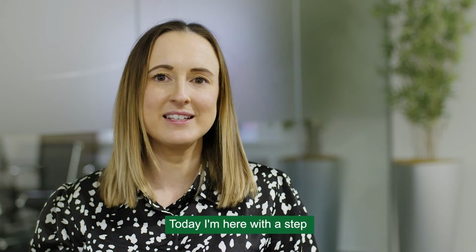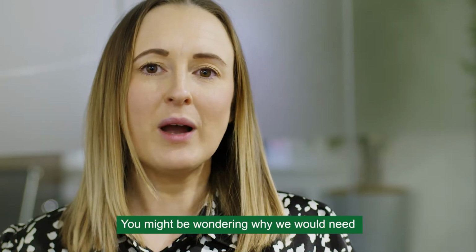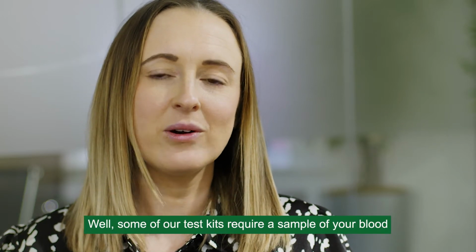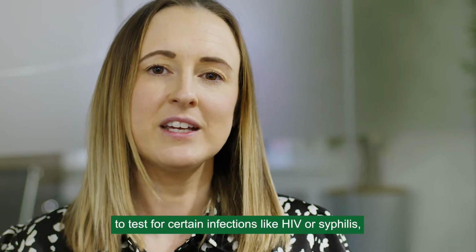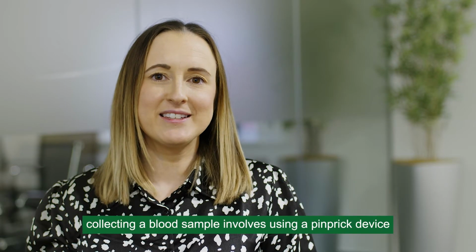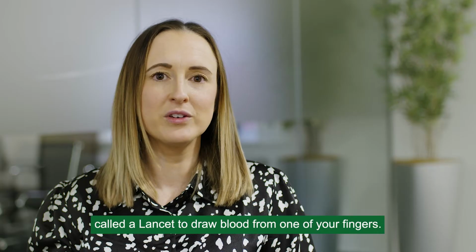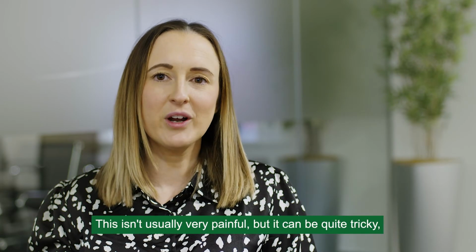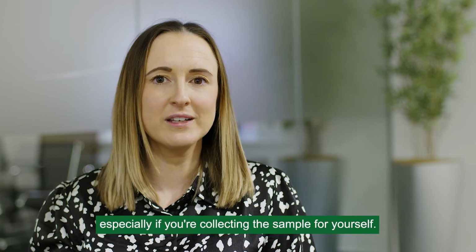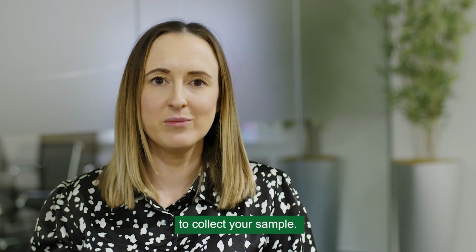Today, I'm here with a step-by-step guide for successfully taking a blood sample. You might be wondering why we would need to take a blood sample in the first place. Well, some of our test kits require a sample of your blood to test for certain infections like HIV or syphilis. Collecting a blood sample involves using a pinprick device called a lancet to draw blood from one of your fingers. This isn't usually very painful, but it can be quite tricky, especially if you're collecting the sample for yourself. So I wanted to give you some advice on the best way to collect your sample.